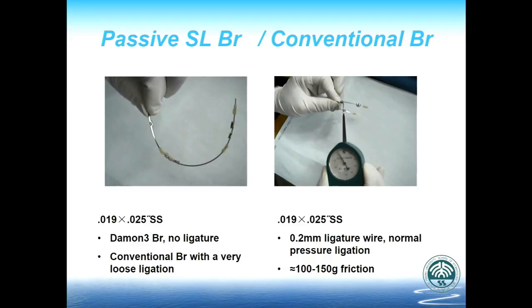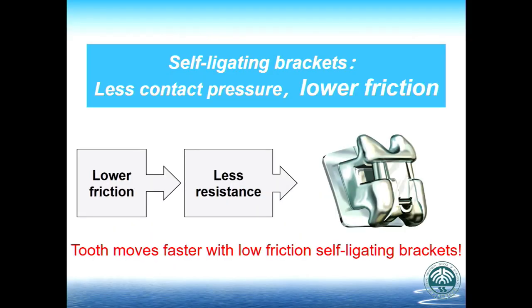You don't need any force to push it. Why? Because self-ligating brackets have less contact pressure, so less resistance and lower friction. Tooth movement can be faster with low friction self-ligating brackets. Like this.